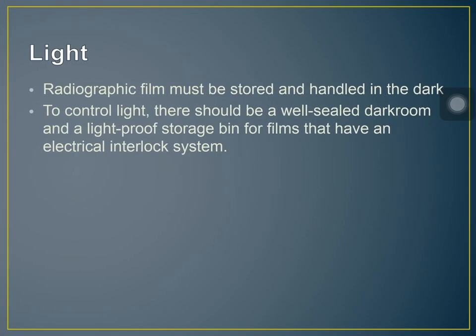Next is light. Radiographic film must be stored and handled in the dark. That's why we have a dark room. To control light, there should be a well-sealed dark room and a light-proof storage bin for films that has an electrical interlock system. So, kung medyo mayaman yung hospital ninyo, meron niyang light-proof storage bin, kung saan doon nakalagay ang mga radiographic films. So, dun sa bin na yun, it has an electrical interlock system.